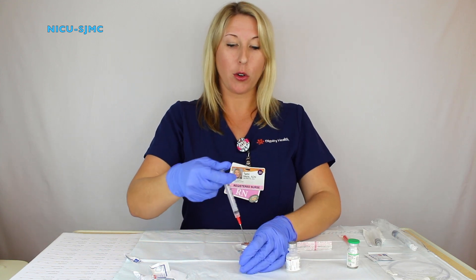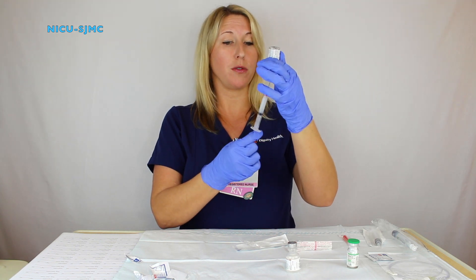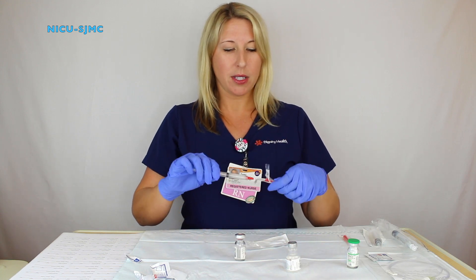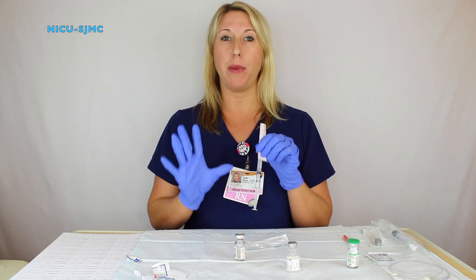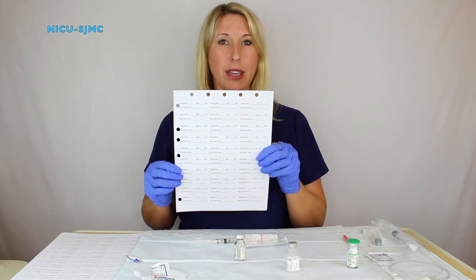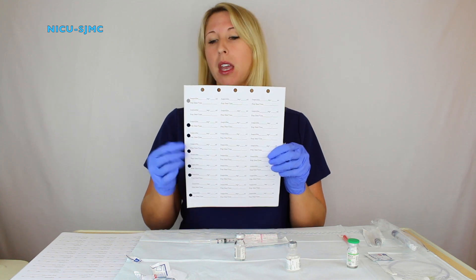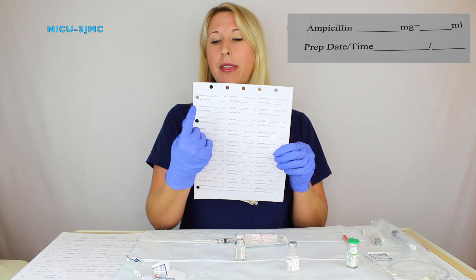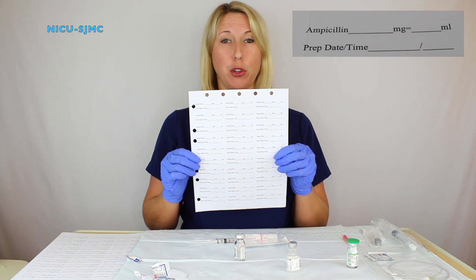Put the sterile water into the ampicillin and shake it up. Pull back your desired dose — for this case we will use 200mg just for demonstration purposes. Now you must label your medication. You should have brought a sticker with you that belongs to the patient so you have a patient identifier. Fill out a label: ampicillin, 200mg equals 2ml, the date and time that you prepped it, as the ampicillin is only good for one hour after it has been prepped.